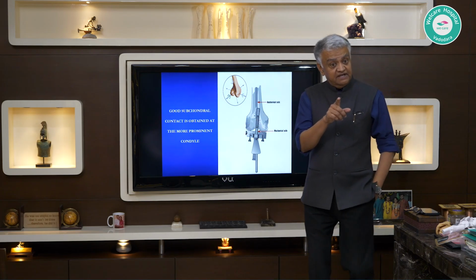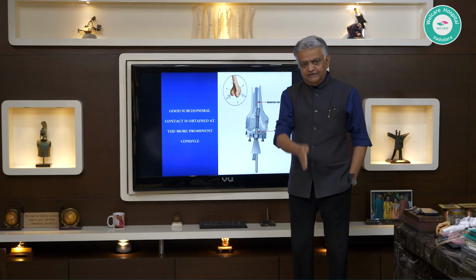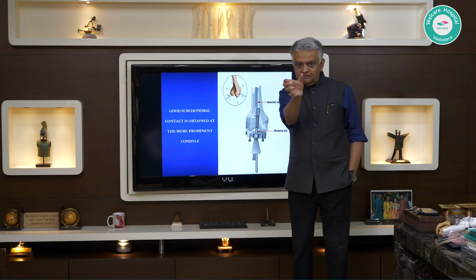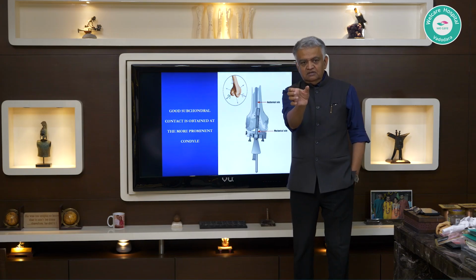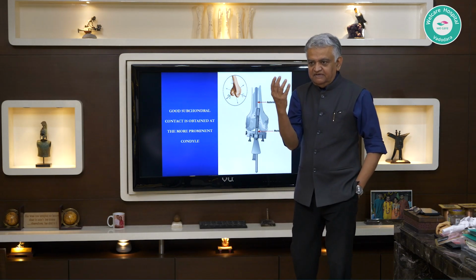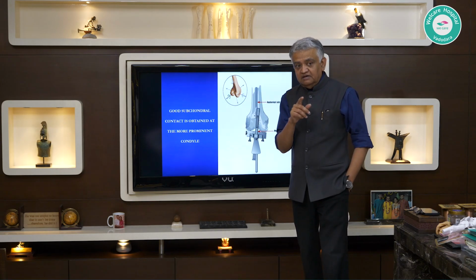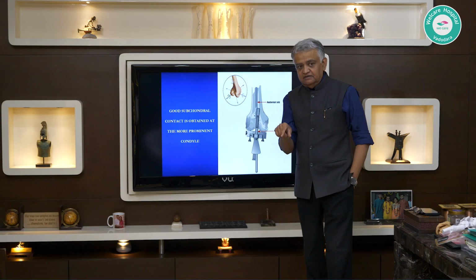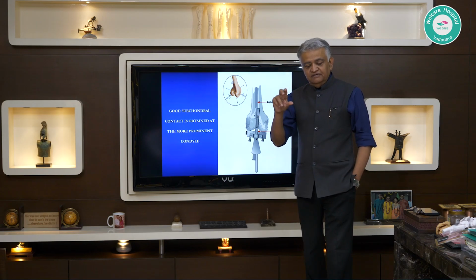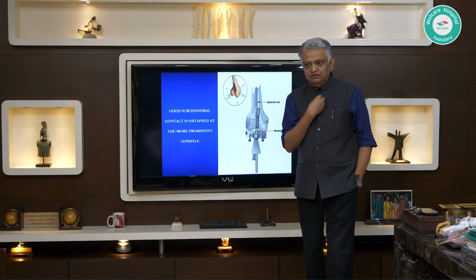He has done it in some cases and showed it, that later on post-operative scanograms look perfect, although the component might look a bit weird on the lower end of the femur from what you are usually accepting as a visual image in the usual circumstance. But Arun in his lectures has shown it, that with navigation he was 100% confident that what he was doing was right.